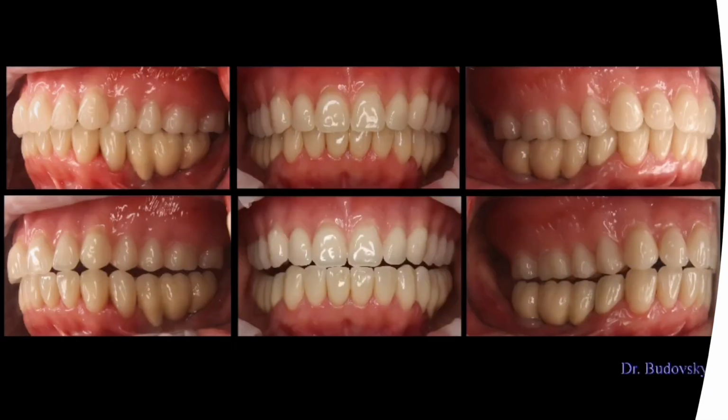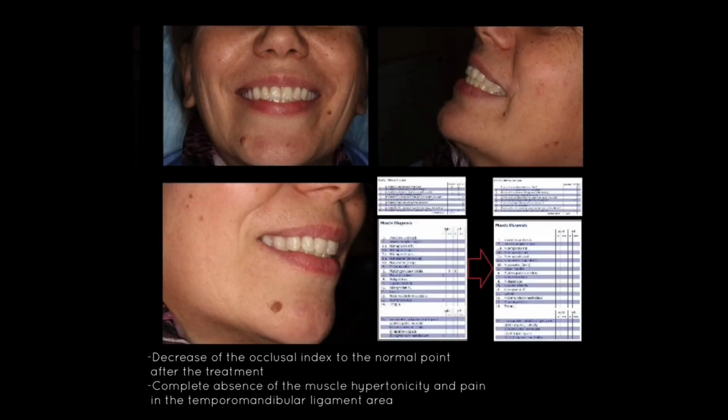And here are the ready dentures that the patient uses for quite a long time. Also, if you look at the slide, you will see that even after prosthetics, we have a very low occlusal index, and we have a good muscle tone, that is, lack of hypertonicity, and the presence of a completely normal reaction to our occlusion.